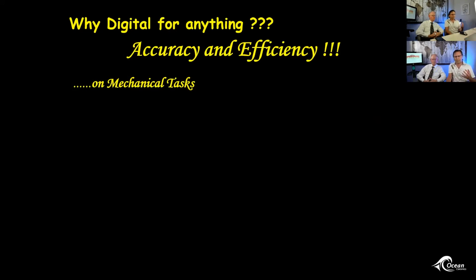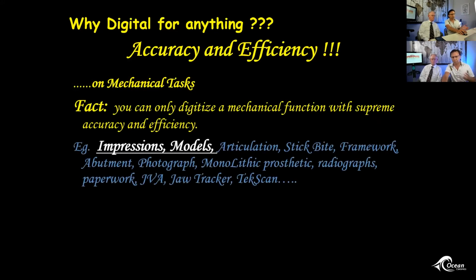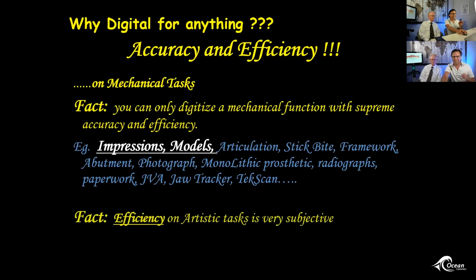So why do we go digital for anything? It's for accuracy and efficiency. Any mechanical task can be digitized. Anything artistic, like picking up a brush and applying porcelain, cannot be digitized yet. I don't think it ever will. But if it's a mechanical task, it can be digitized. You can only digitize a mechanical function with supreme accuracy and efficiency. Impressions, models, articulations, bites, frameworks, abutments, photographs. Because efficiency on artistic tasks is very subjective.